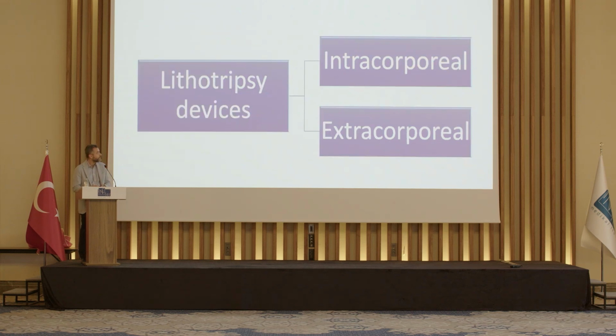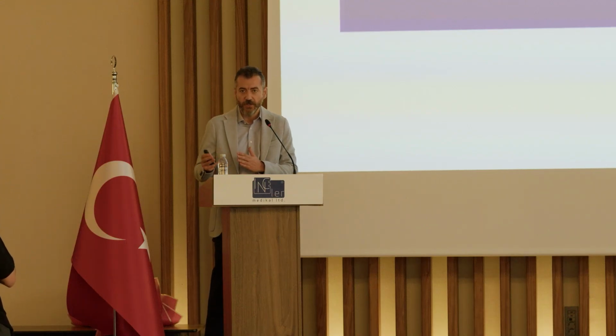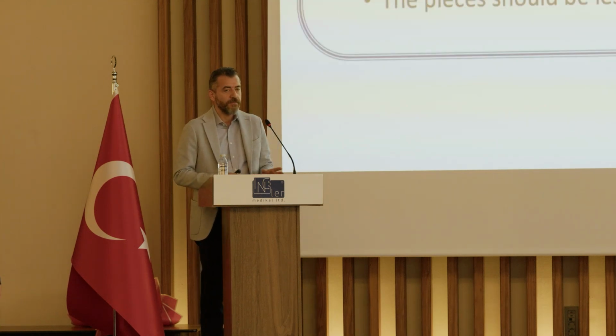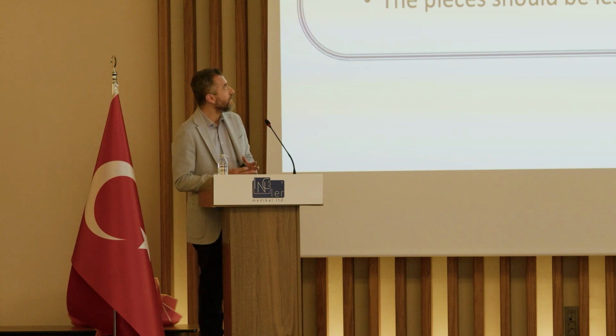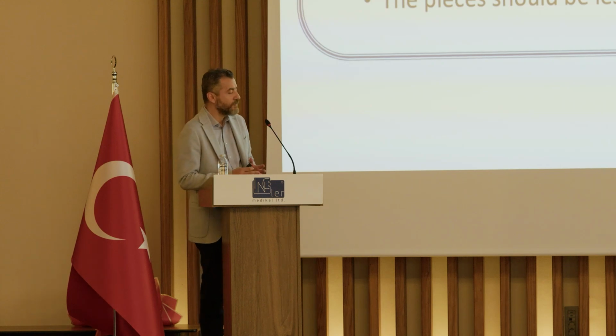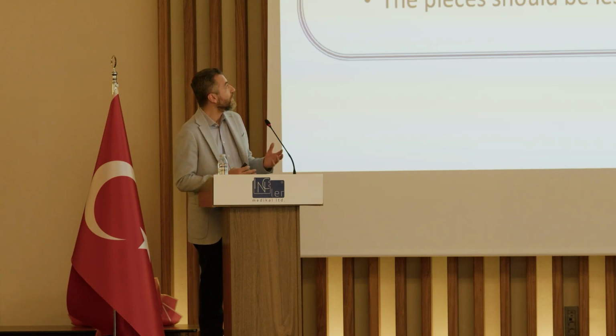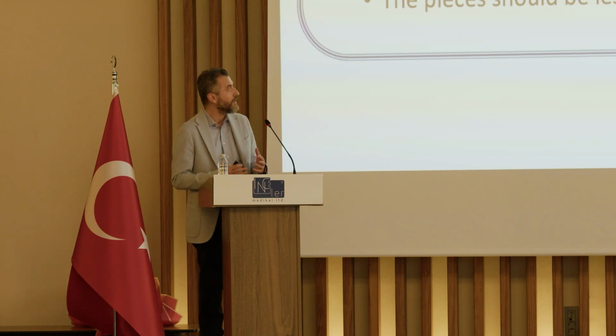during our practice. So regarding lithotripsy devices, we actually have two different strategies. One is the intracorporeal lithotripsy that we use during the surgery, and the other one is the extracorporeal lithotripsy, the shockwave device we use to disintegrate the stones. So for the stones, actually we have mainly two strategies. What we need to do is we need to fragment the stone into finer pieces and take them out of the body.